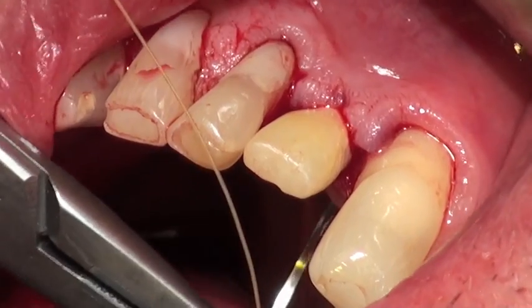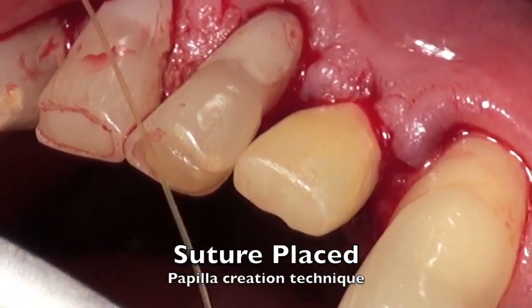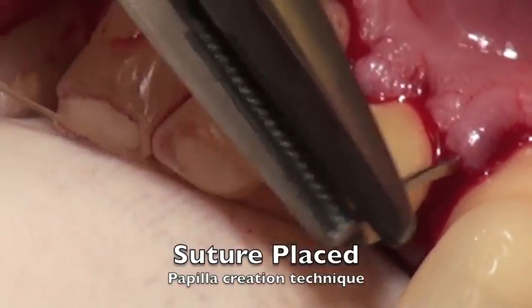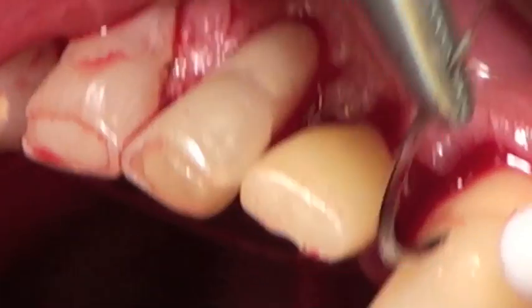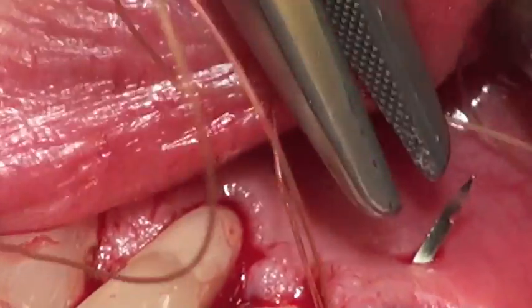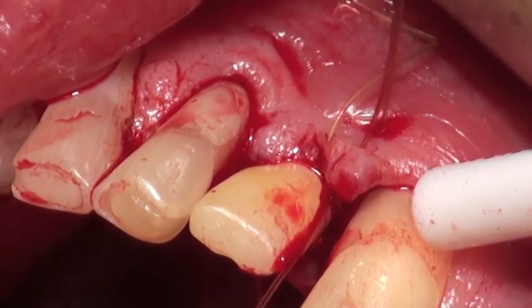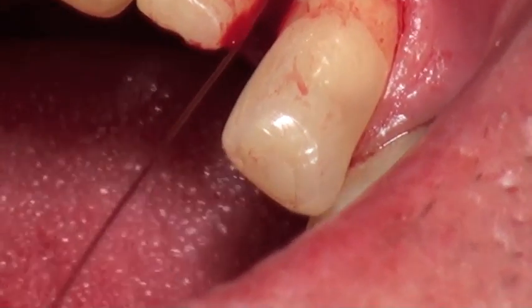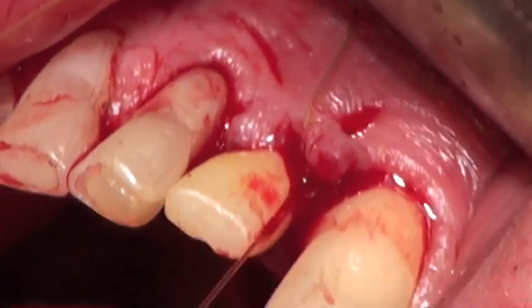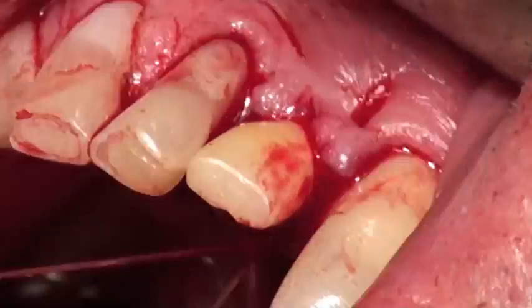Now we get into the suturing techniques, using a suture technique here to create the papilla. We come through the lingual to have a stabilizing area, then take the suture down low — we're using gut here, though I usually prefer Vicryl sutures. We come low on the papilla — not over the top but underneath and through — so we can lift that papilla up. By lifting it up, it helps create the new architecture shaped around the temporary crown, allowing for a very beautiful papilla. It's hard to recreate papilla, so this is a great technique.